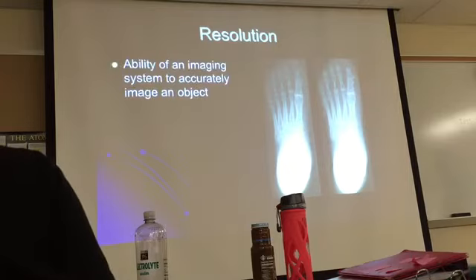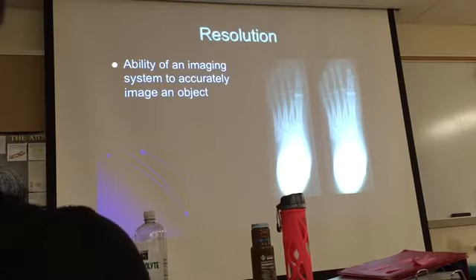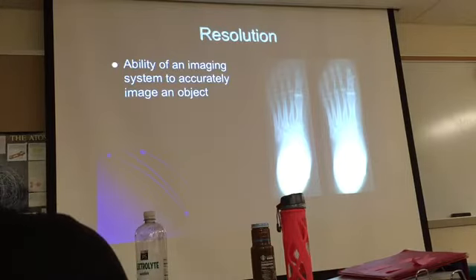All right, so now we're switching gears. We have to explain what resolution is. We're going to come back to this concept when we study density and contrast, but I have to give you a little bit of resolution since we're talking about intensifying screens.